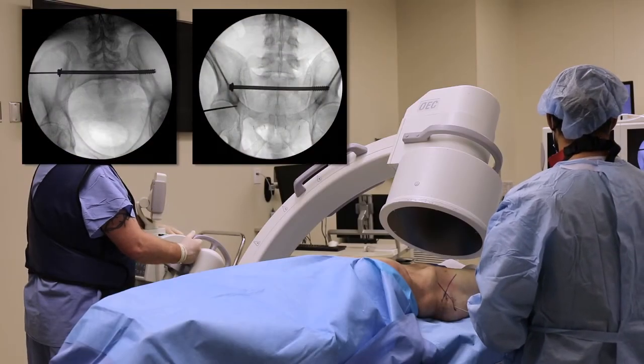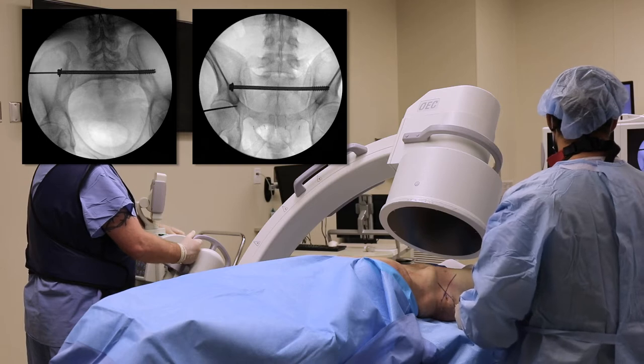In this video, we're going to cover placement of an ileosacral screw in S2 in a patient who has already had an S1 transsacral screw placed.